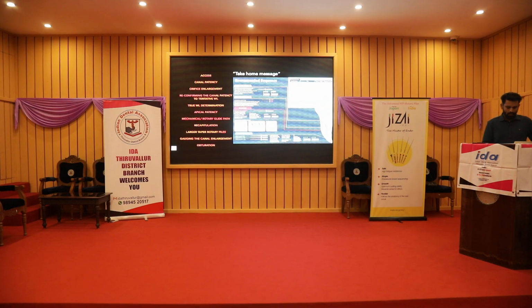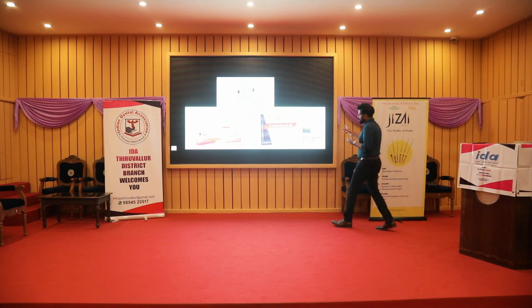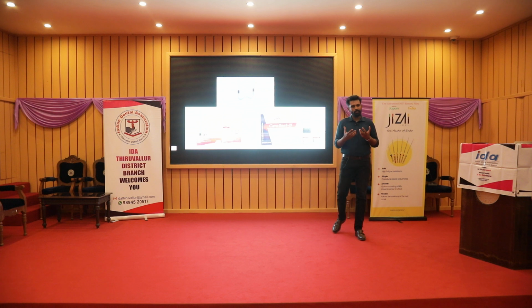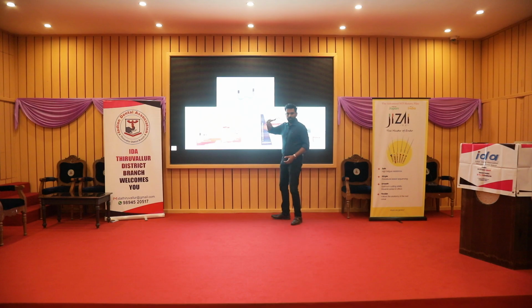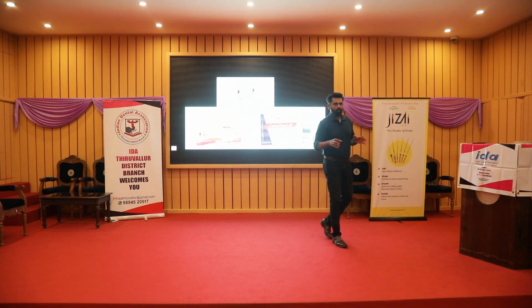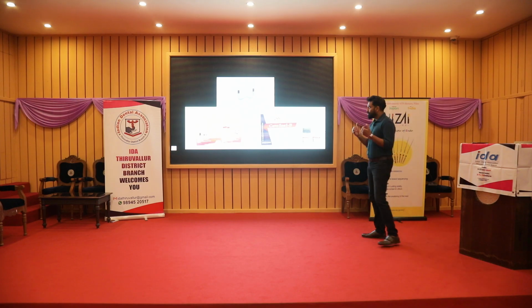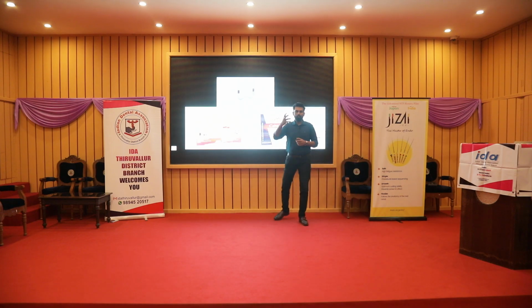In my practice, I mix this powder and liquid and use the GP to obturate. If the patient is ready to spend more money, I can go with the CeraSeal pre-mixed version, inject it inside the canal and obturate. There is no need for GP itself. But preferably, if you feel the chances of reinfection are comparatively high, use it along with your GP. Because CeraSeal, mattu use panni anterior la obturate pandringa vechuko.